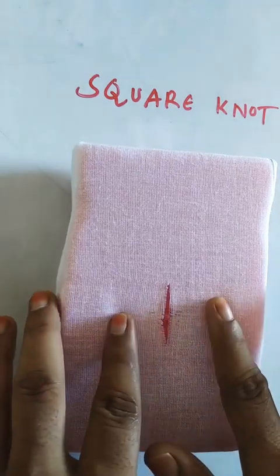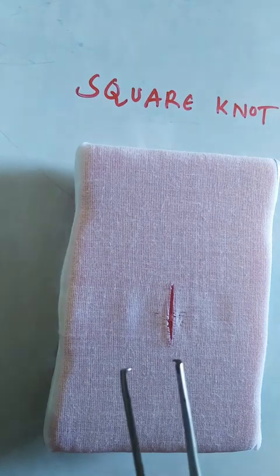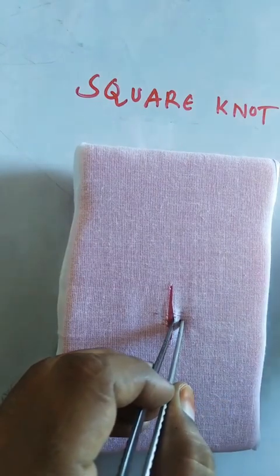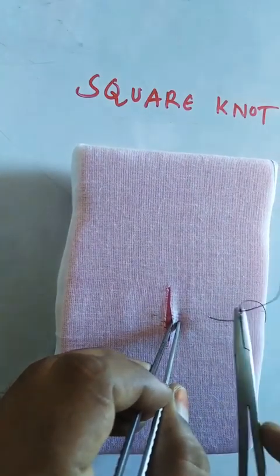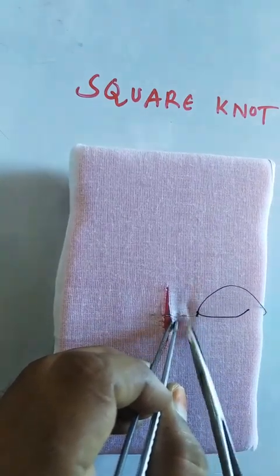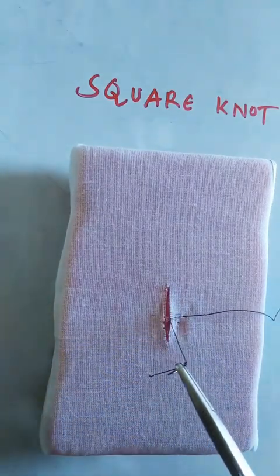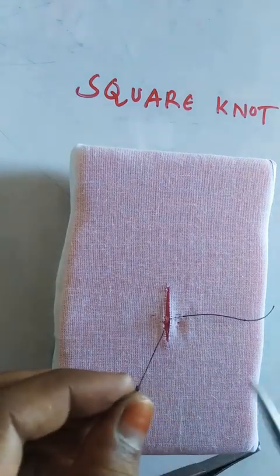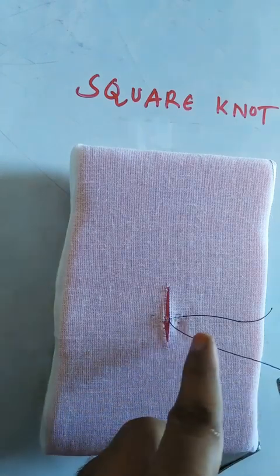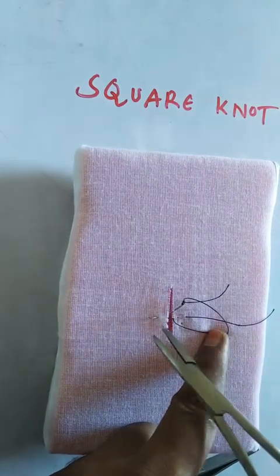This is your incision site. There are two flap edges, right? So before suturing, you have to use adson tissue holding forceps to grab one edge, and then you have to pass the needle perpendicular to the tissue. Initially, you pass through only one tissue edge. Then you can redirect the needle to grab the other side of the tissue edge.